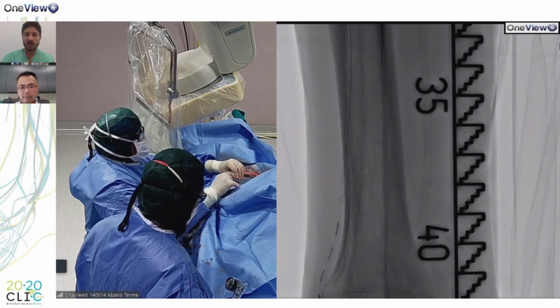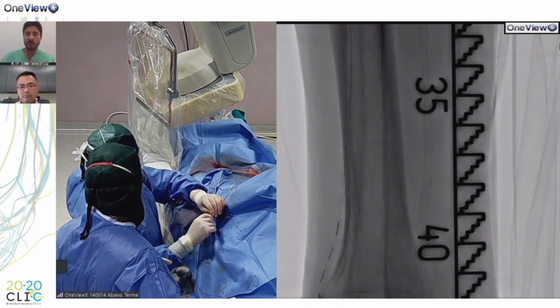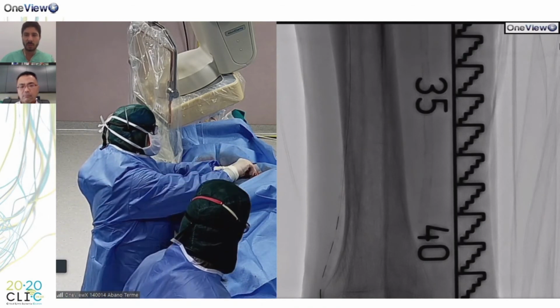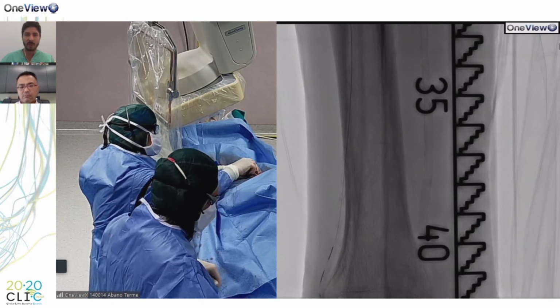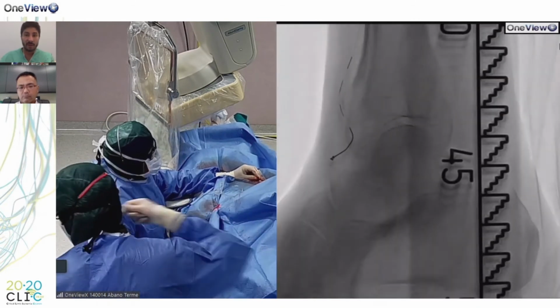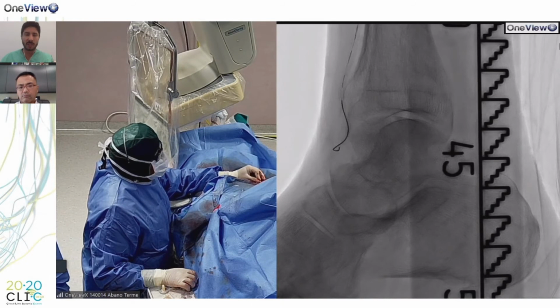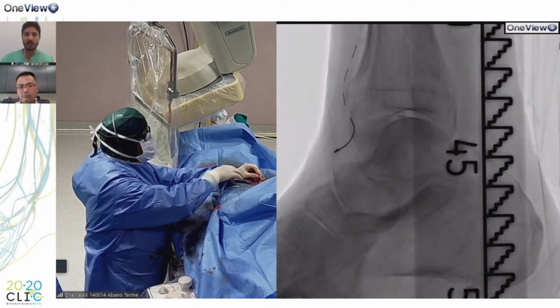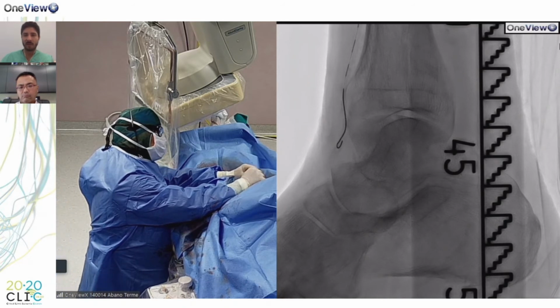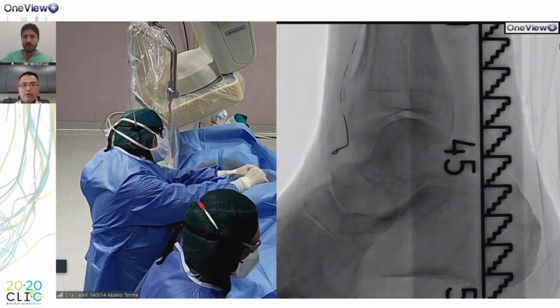Yeah, I personally fully agree, but I'm specifically curious in that case because the balloon transition was before the pre-dilatation was more or less the same as the atherectomy. So it means that the lesion was very, very challenging, and the atherectomy device arrived close to the ankle and was not able to progress, and it was the same with the balloon before the pre-dilatation. So very nice activity of the debulking device. Very nice pushability and crossability power.